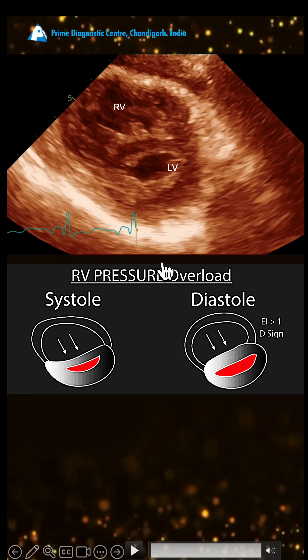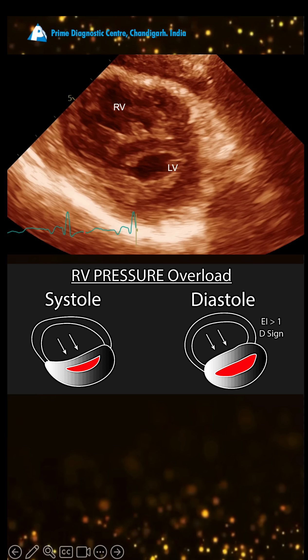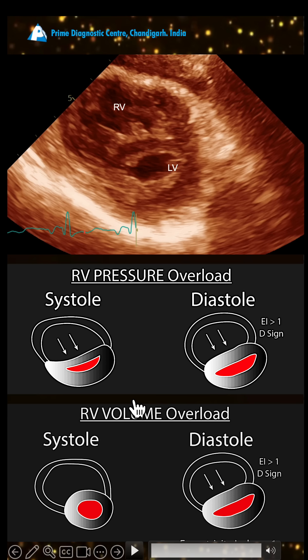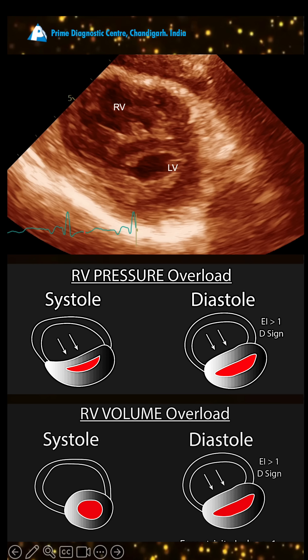The D sign has specific clinical implications. If it occurs in systole, it indicates systolic overload — RV pressure is high in systole, meaning pulmonary artery hypertension or severe PAH. If it occurs in diastole, it indicates volume overload, such as in ASD or severe tricuspid regurgitation.